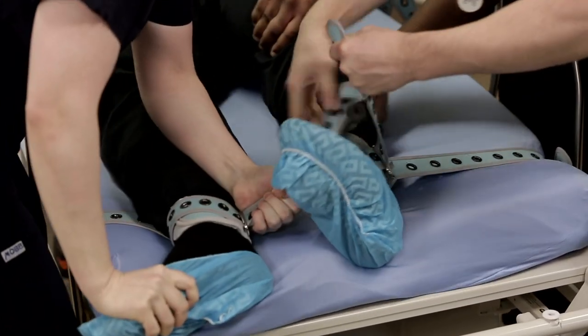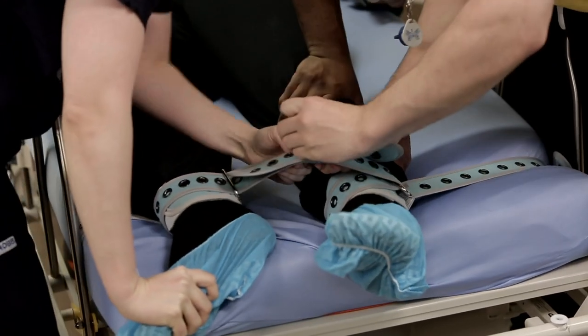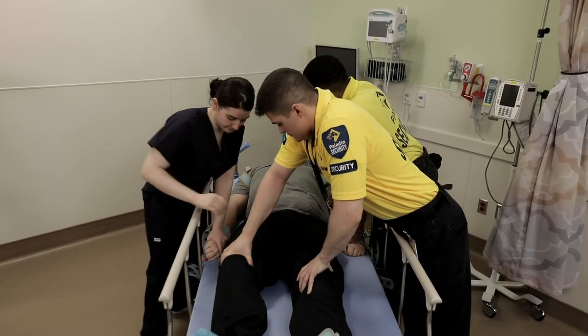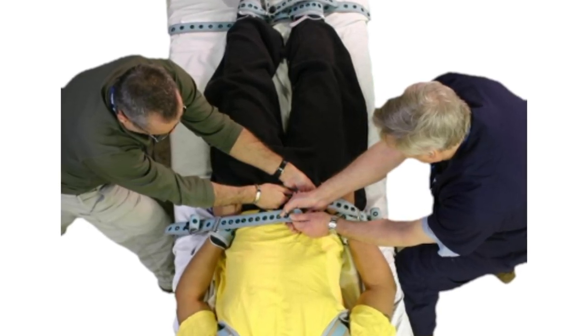This gives clinicians the opportunity to discuss the patient's condition and next actions. If the strategy is to sedate the patient, a team member can pull the short strap across the patient's body to present a still arm muscle site for injection.